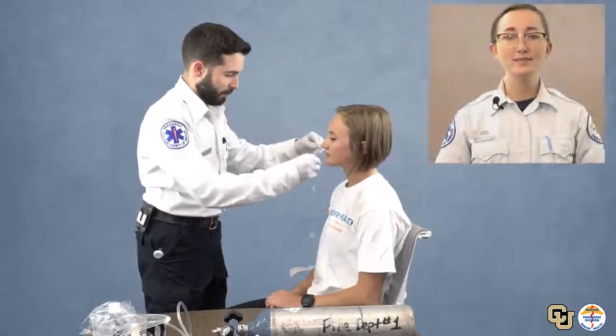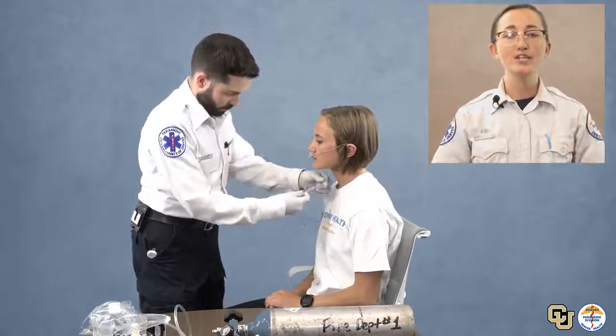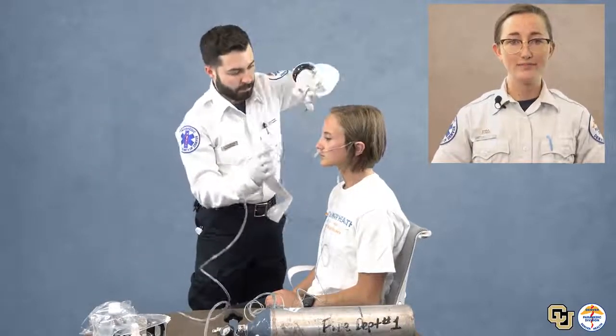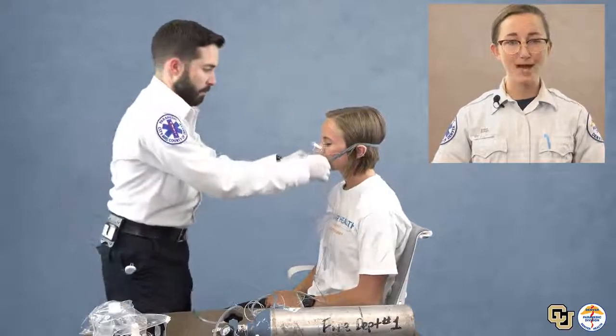Let's practice body substance isolation and don our gloves and eye protection. We want to make sure our patient has supplemental oxygen via a non-rebreather or face mask with a nebulizer in place while we are getting our equipment ready. If they don't need a non-rebreather for their respiratory distress, they probably don't need CPAP.